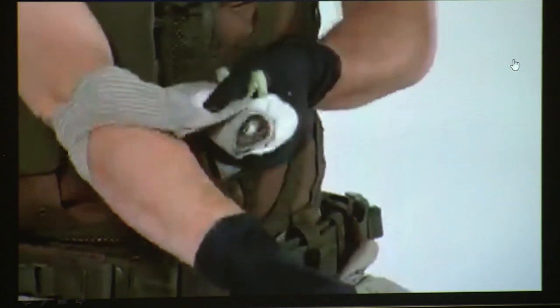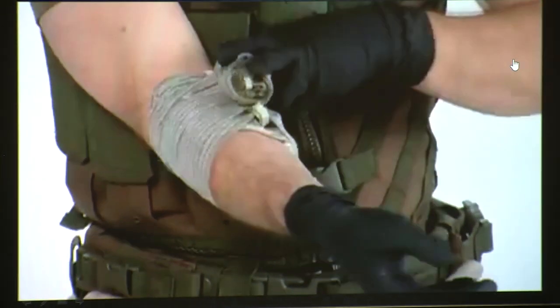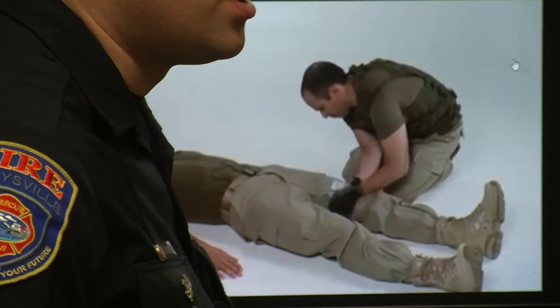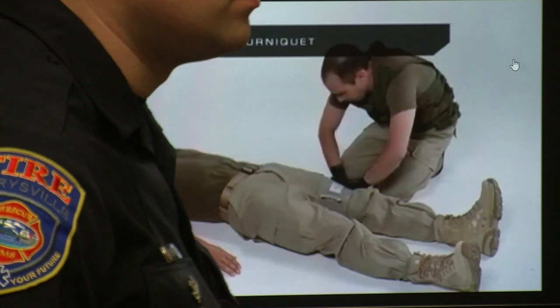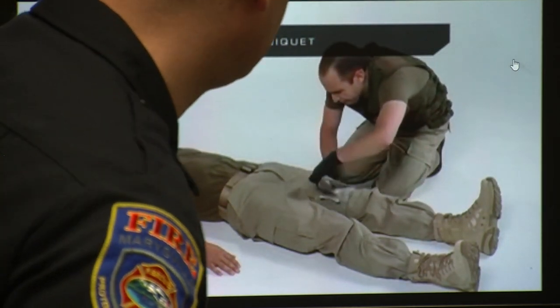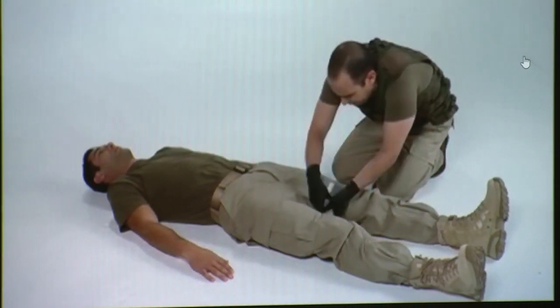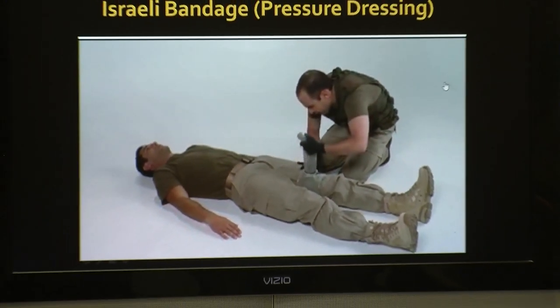You can also use the cloth loop near the pressure applicator. Again, bring the pad to the wound area. Wrap and close, until the end. Until I saw the video, I never realized that loop was at the end. You see, there's a little loop. It would make it easier for you to do this one-handed.